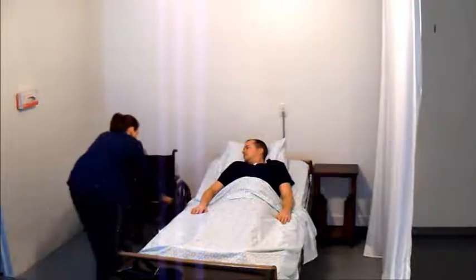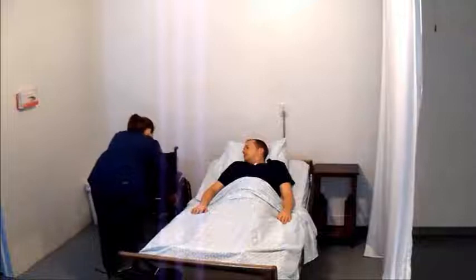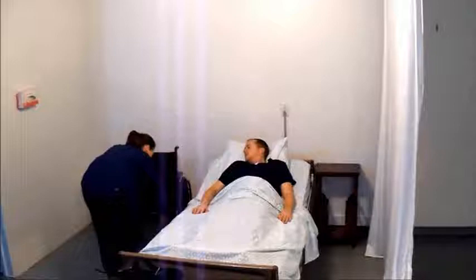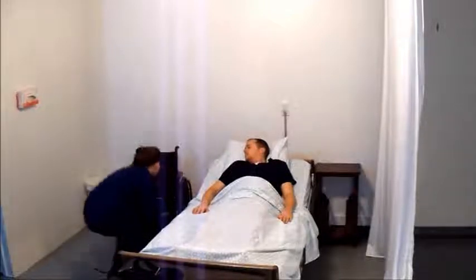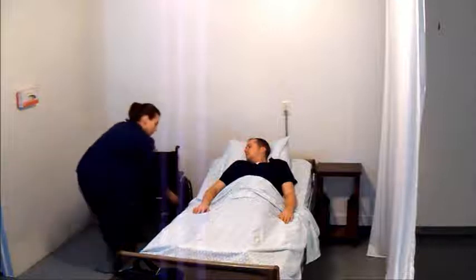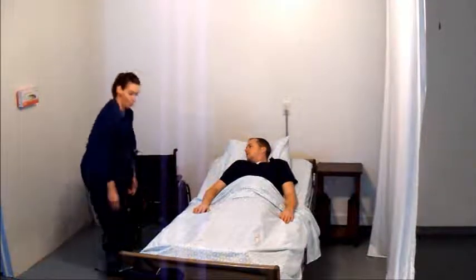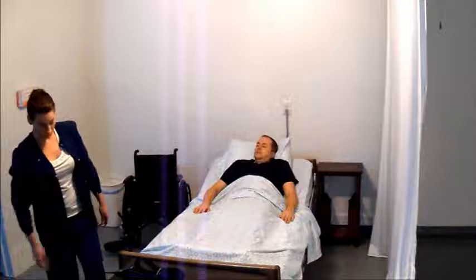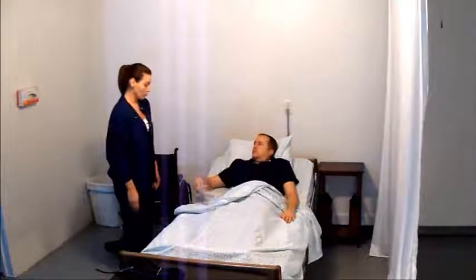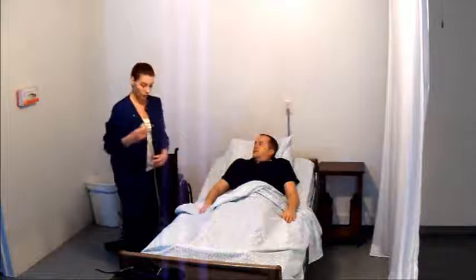Provide the resident opportunity to sit on the side of the bed to adjust to the change in position before beginning the transfer. Position the resident's feet flat on the floor before standing to begin the transfer. Prepare for the transfer by positioning the wheelchair with the front interior wheel close enough to the bed so that the transfer can be completed as a pivot.